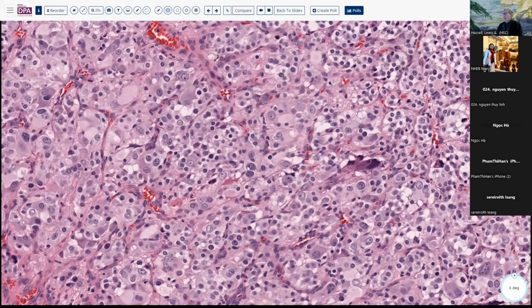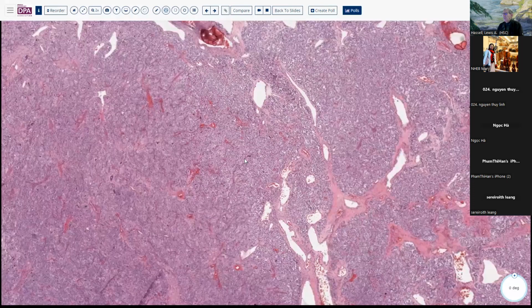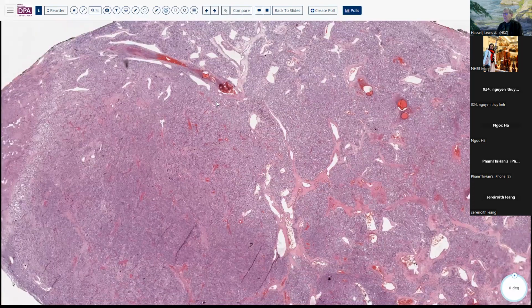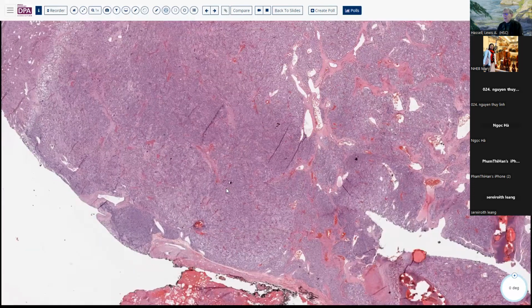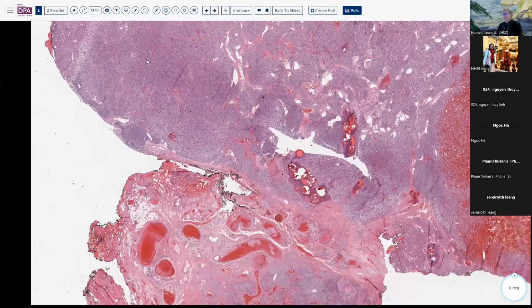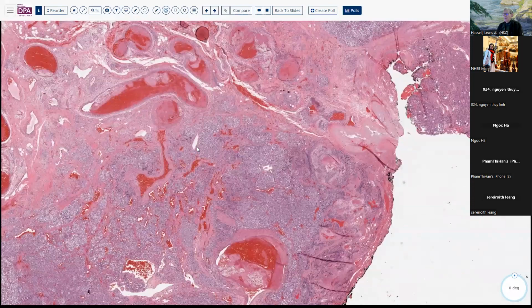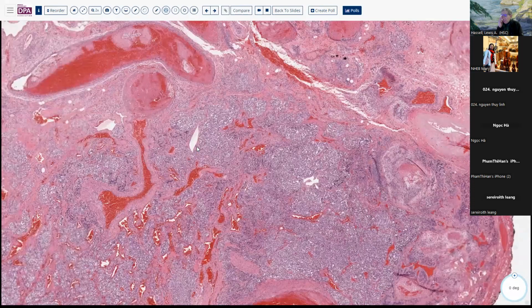So here's one example, and you can see the variability and the very vascular nature of this lesion. They can look sort of angioinvasive because they're very vascularized and are associated with the circulation around these chemoreceptors in the mediastinum, the neck, and elsewhere.